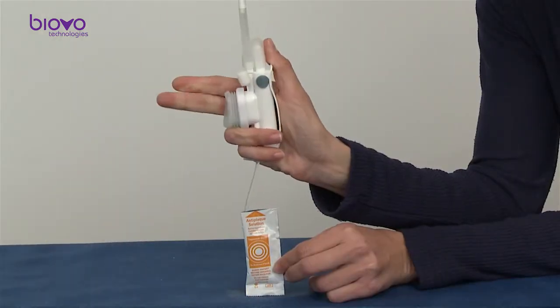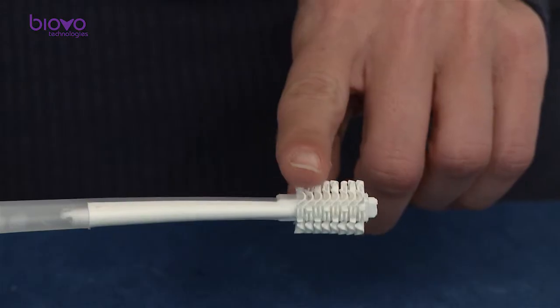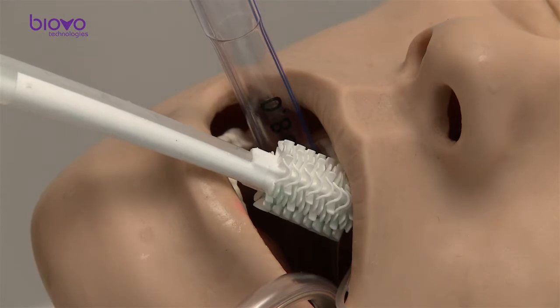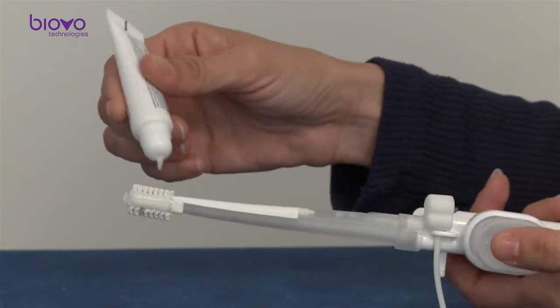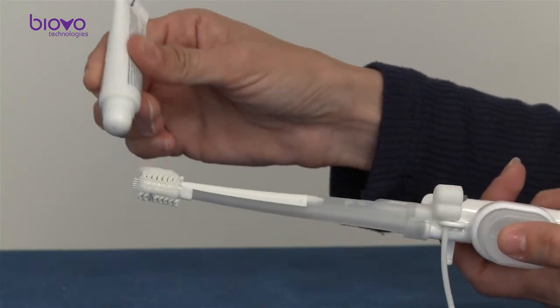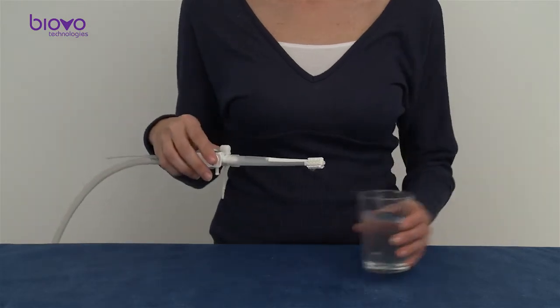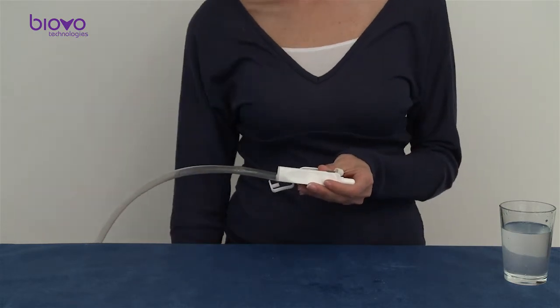Mouth rinse and moisturizing is done with the same tools in the same way. Special wide bristles are designed for easy spreading of moisturizer. You can use the same brush head and spreading bristles also to apply moisturizing gels and creams. When done, clear the suction line, disconnect and discard the brush, and discard the inlet tube.